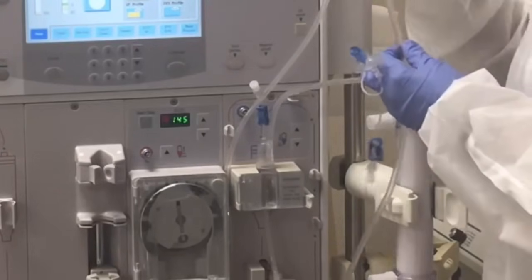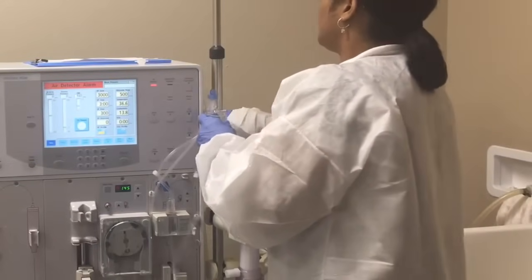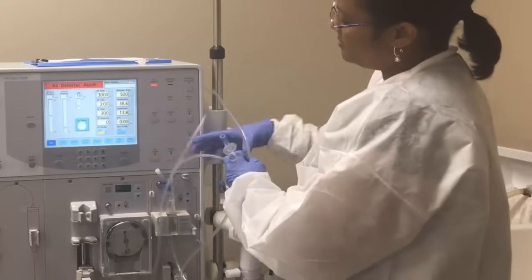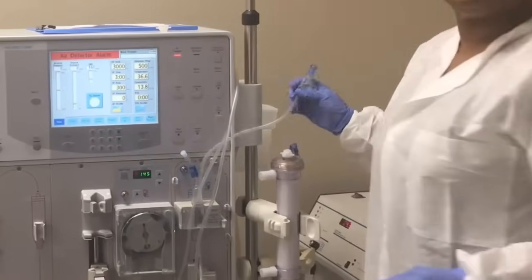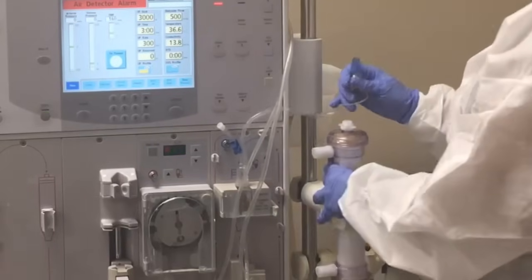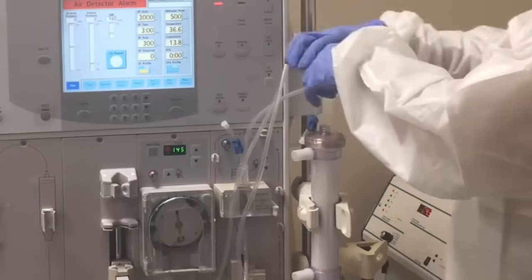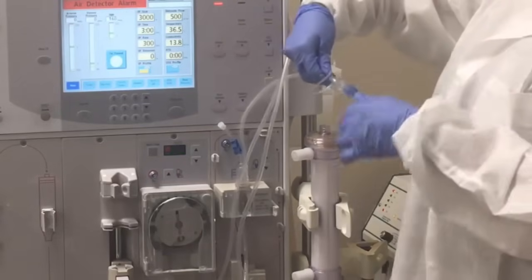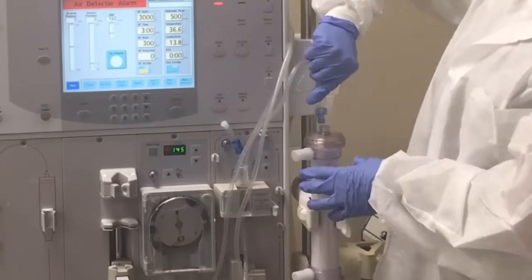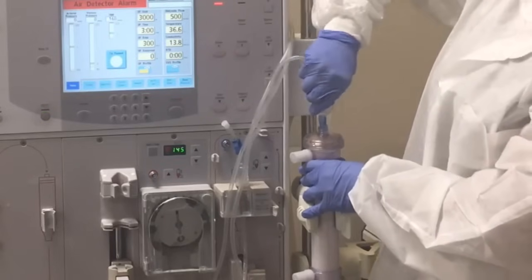Now you want to take the patient end and place it inside of your draining bucket. Then go ahead and connect your filter end onto your filter. I like to twist it counterclockwise so that when I connect it, it connects well and sits straight.